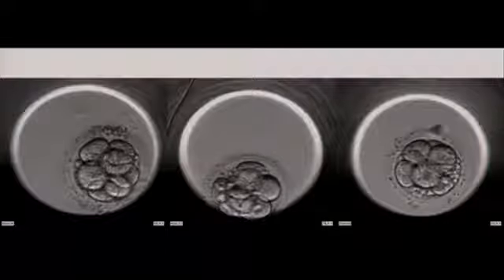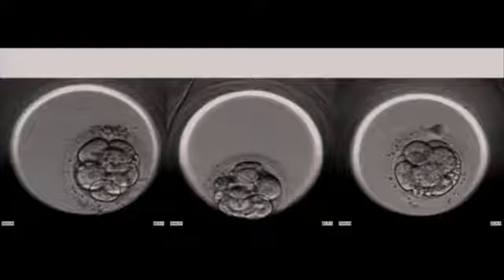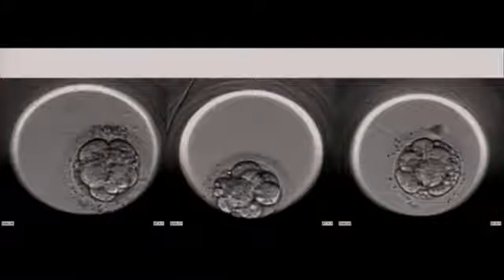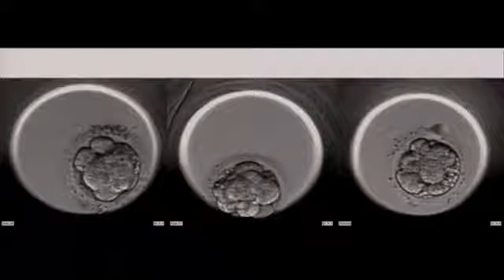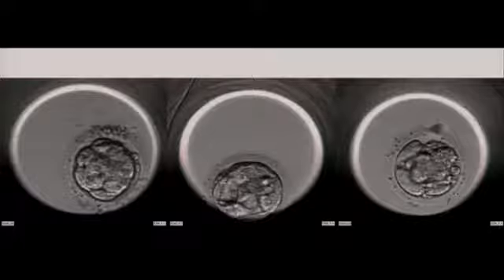And you'll see that some of these embryos actually have a different history, or they finally have a different fate. So you will see that they start growing very similarly, but then as we go along, they actually change in the way they're developing. So the one on the far right actually starts growing much more poorly, so it's not growing that well. Whereas the one on the left and the one in the center are showing better features of development.